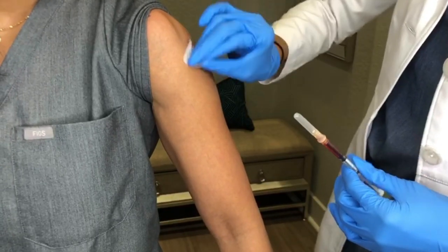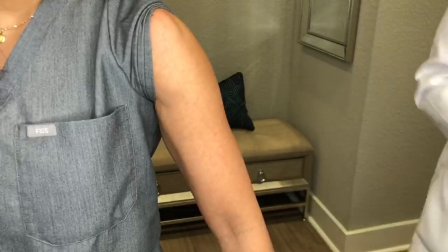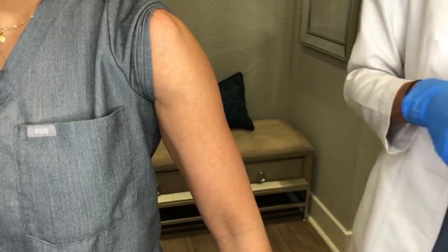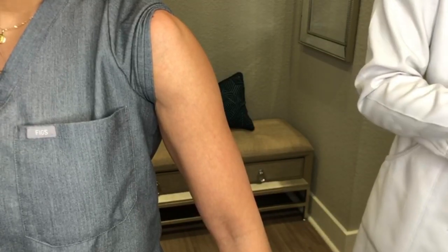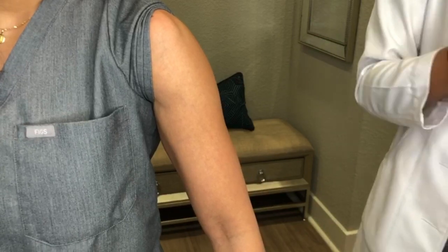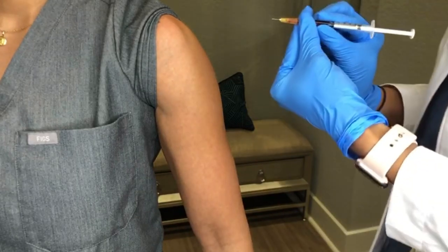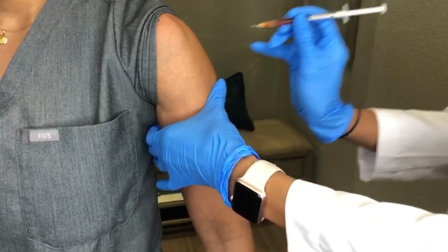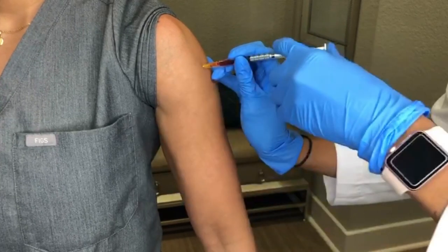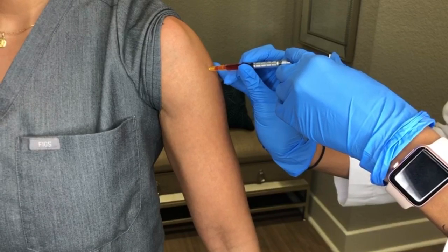When you're ready, clean the area with an alcohol pad. Allowing the alcohol to dry first will reduce any burning sensation. Remove the cap from the syringe and make sure the needle is beveled side up. Keep the syringe at a 90 degree angle from the injection site and use a dart-like motion to swiftly inject yourself to reduce any discomfort.